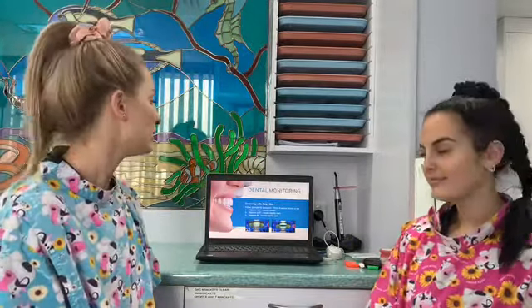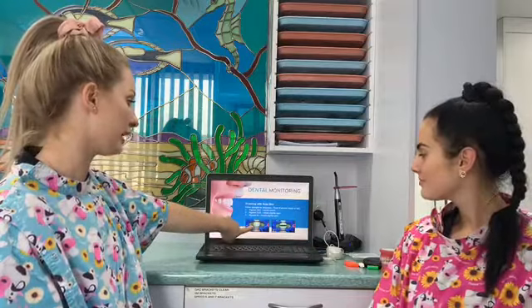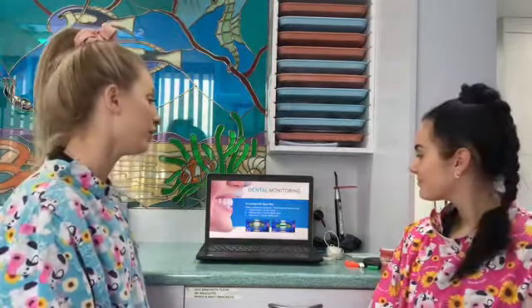So scanning with a scan box, we want to make sure that you're following the dental monitoring instructions, and we take 3 6-second scans. So the first scan is with your aligners out and your mouth is slightly closed like this. Then we're going to leave your aligners out and do another scan with your mouth slightly open, making sure when you open that your teeth are only a finger width apart. And then for the third scan, we're going to put our aligners in and do another one with our mouth slightly open.